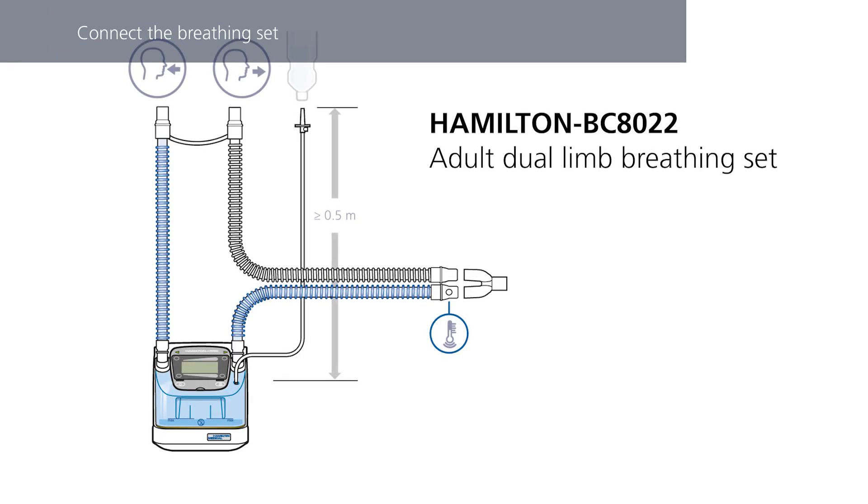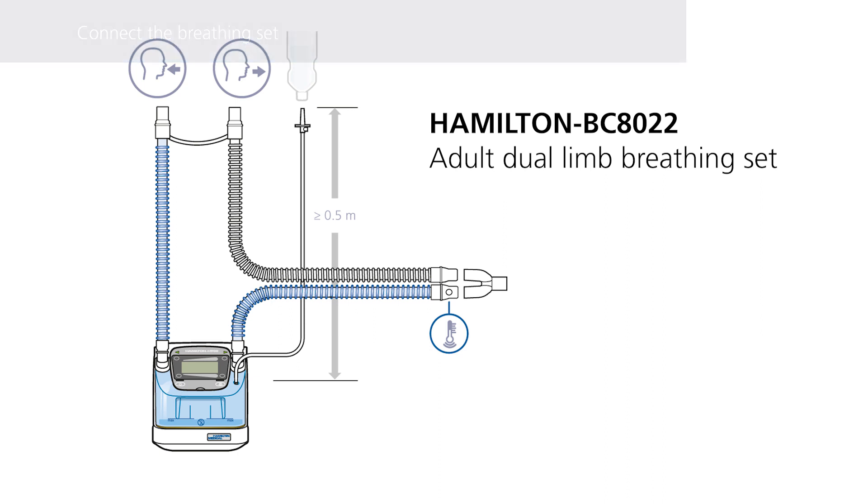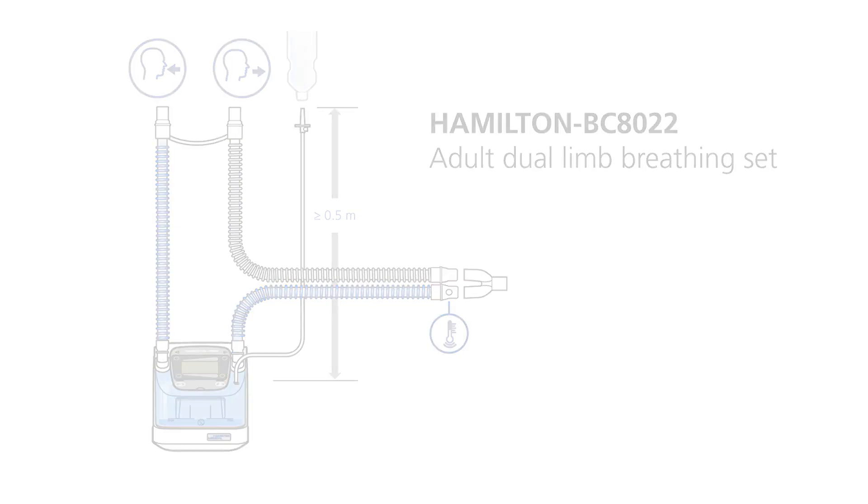Choose the correct breathing circuit according to the patient group or selected treatment. The following information applies if you are using the Hamilton BC8022 breathing circuit or any other double-limb breathing circuit for an active humidifier.